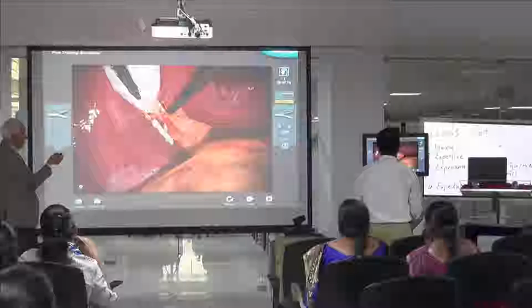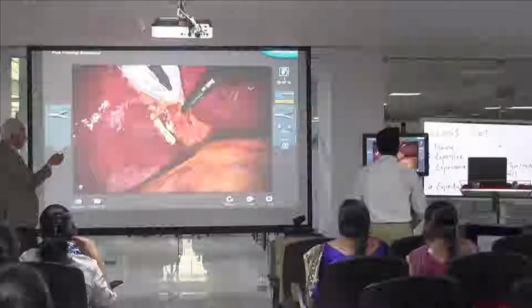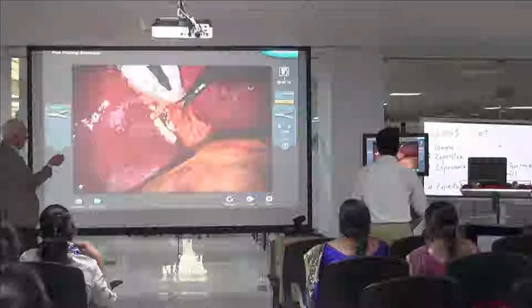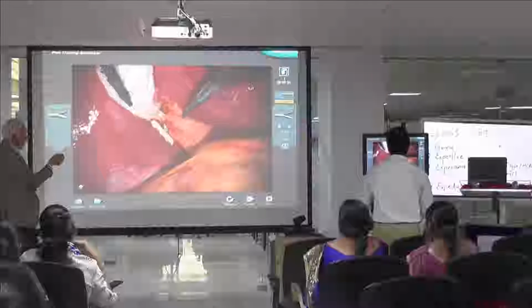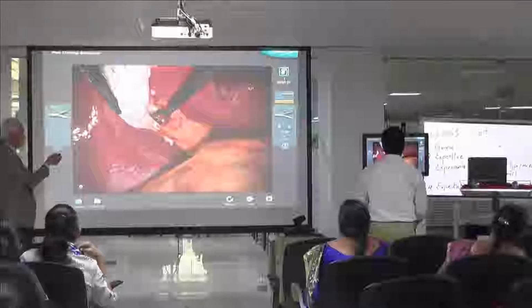Here. And still a bit of peeling off the tissues. And blunt dissection, opening the dissector.